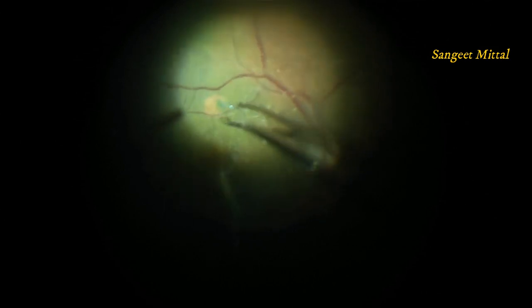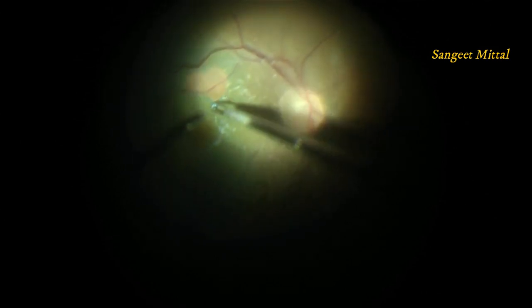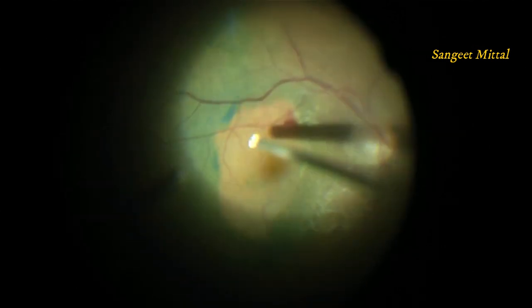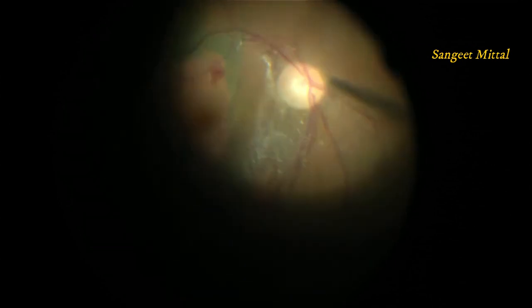ICG dye was used to stain the ILM. ILM peeling was initiated. Only then, the removal of vitreous layer was possible.